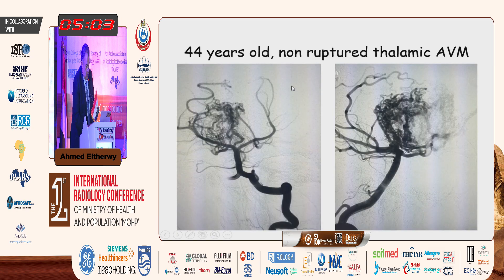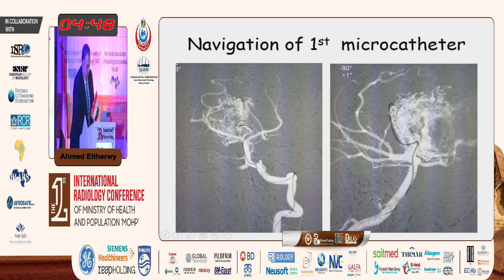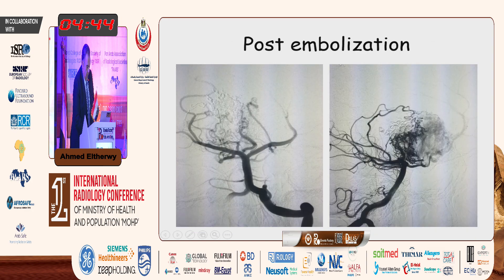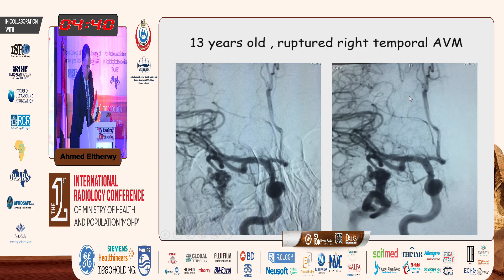I put this case to demonstrate that even with very small arteries, you can use the pressure cooker technique, placing two micro catheters. This is a thalamic AVM and we used the pressure cooker technique in the small artery of Percheron. Here we can see the first micro catheter placed, then the second micro catheter placed — pressure cooking and embolizing part of this arteriovenous malformation present in the thalamus.